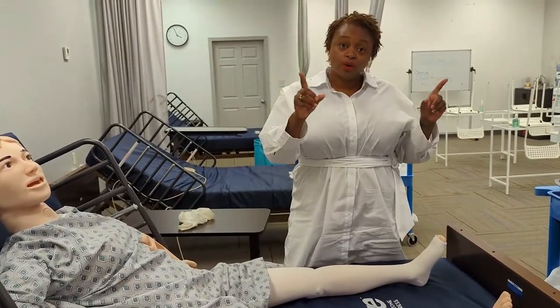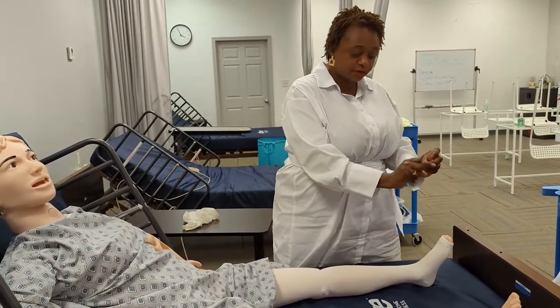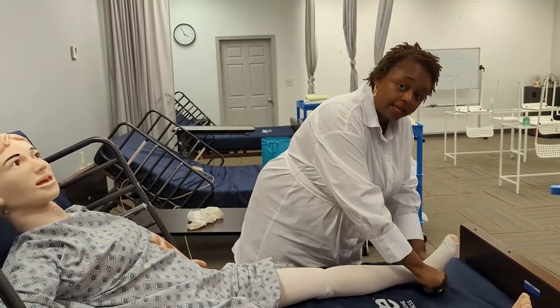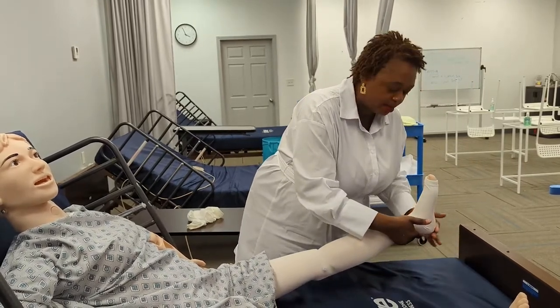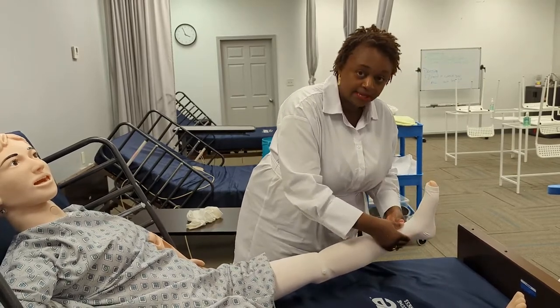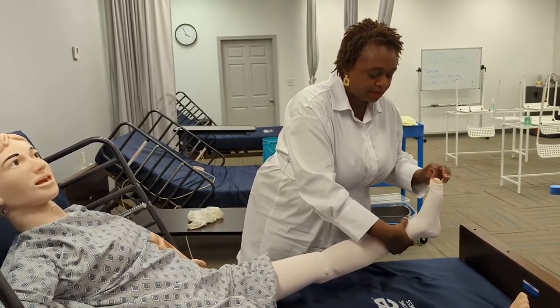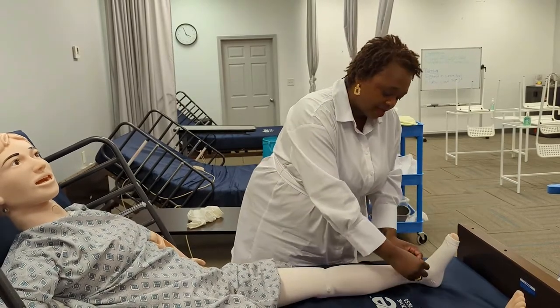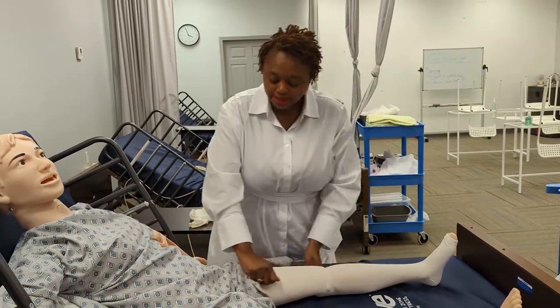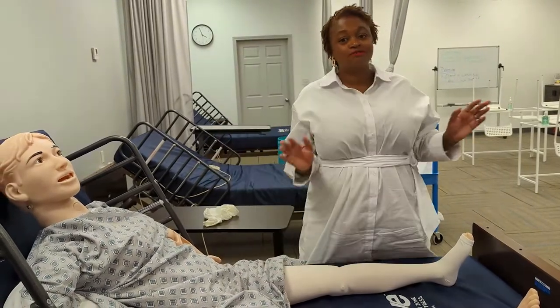Quick recap: that first part is a little uncomfortable and super tight. Brace the ankle as much as you can, get it on the foot, and get the heel situated in the correct position. Once you have that, smooth out the foot, then roll up and smooth as you go along. Don't just get it all the way up and have all those wrinkles.